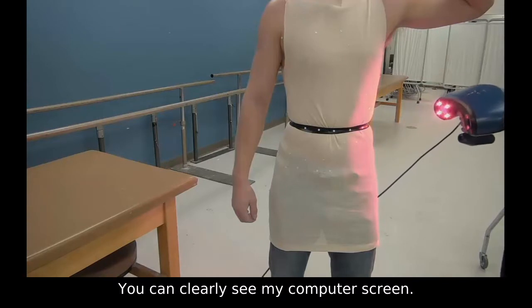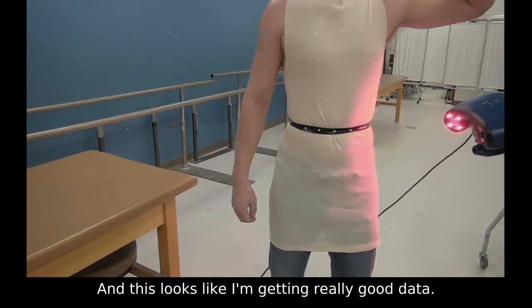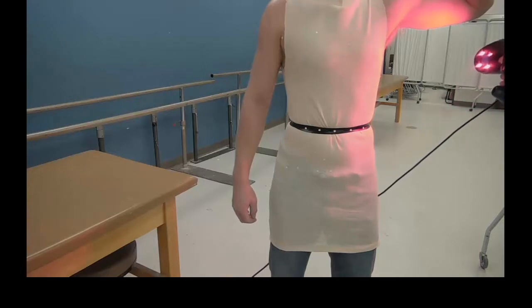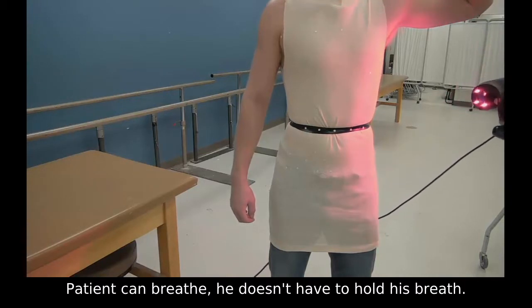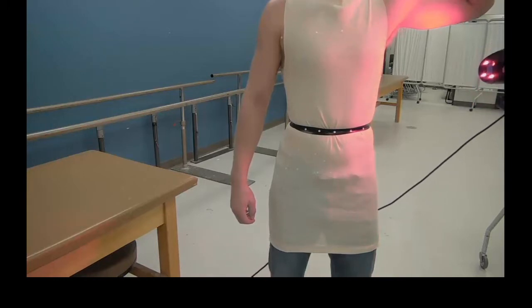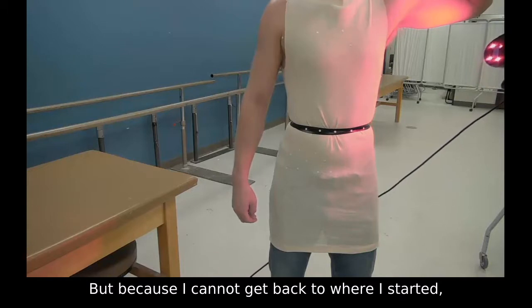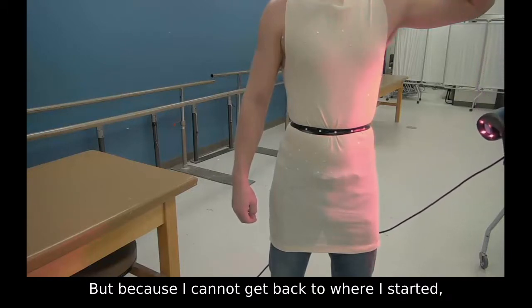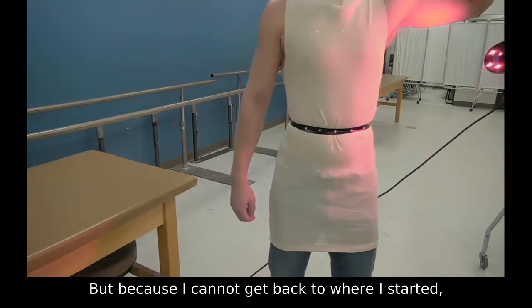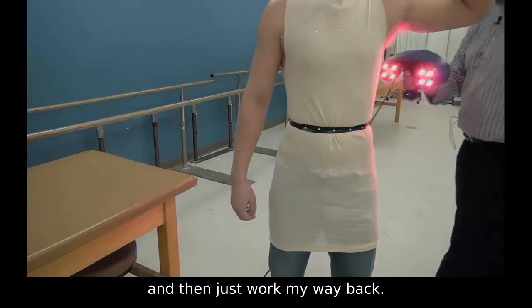I can clearly see my computer screen, and this looks like I'm getting really good data. Patient can breathe, he doesn't have to hold his breath. But because I cannot get back to where I started, I get as much data as I can and then just work my way back.